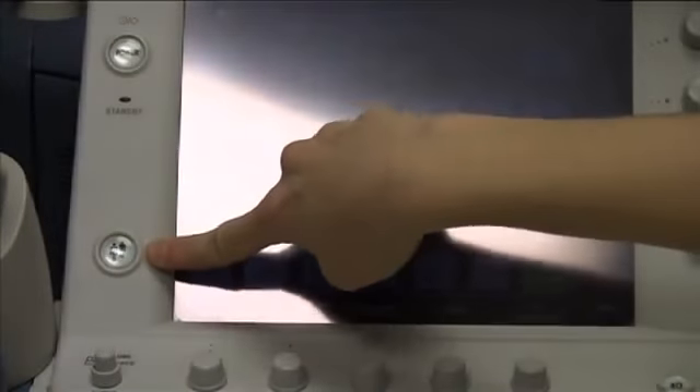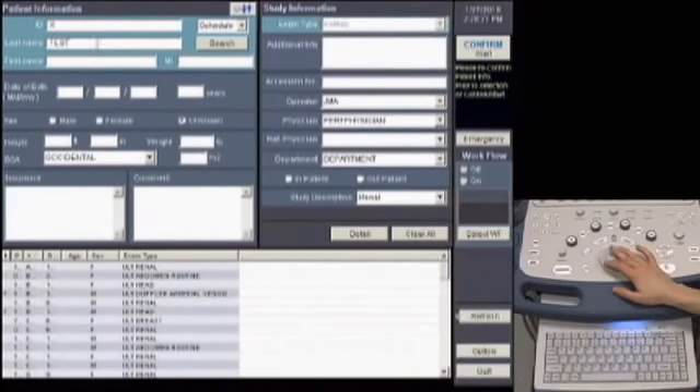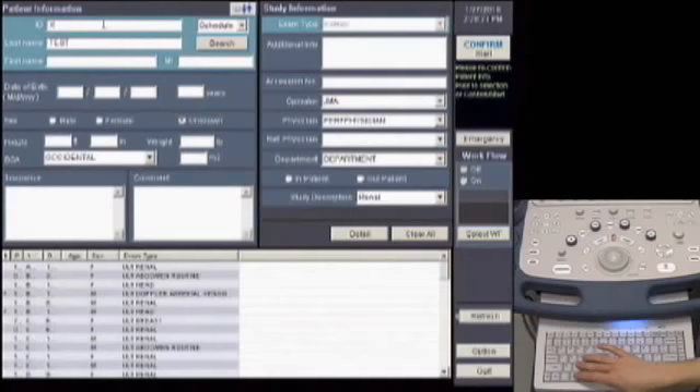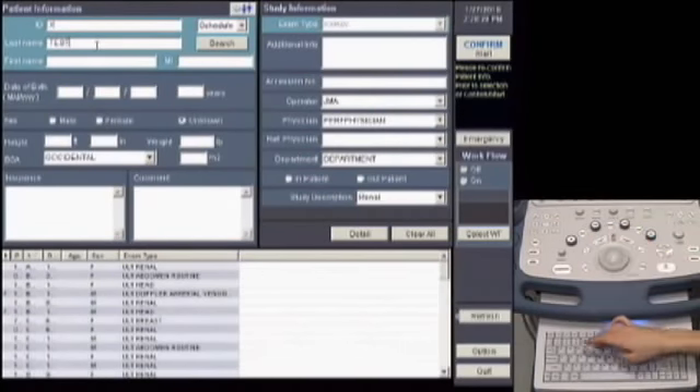Now we're finished scanning the phantom and we're going to scan our own radial arteries. Before we do that, we need to end this exam — press the patient button to return to the initial screen. We're going to enter a new exam. For patient ID, enter X, and for patient name, enter 'test'.